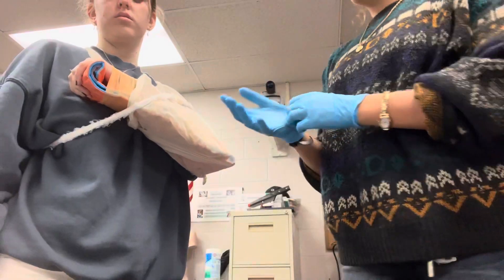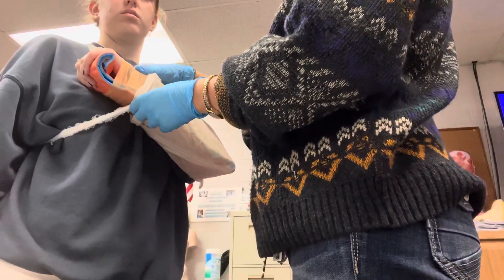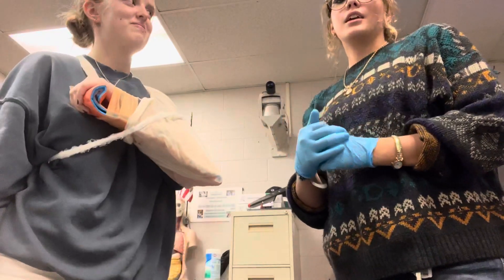Once she is splinted, I will recheck CMS. I'll check for a pulse again. Ma'am, can I have you wiggle your fingers? And then what finger am I touching? Done. Perfect. Motor, sensory, and circulatory functions are present and normal.